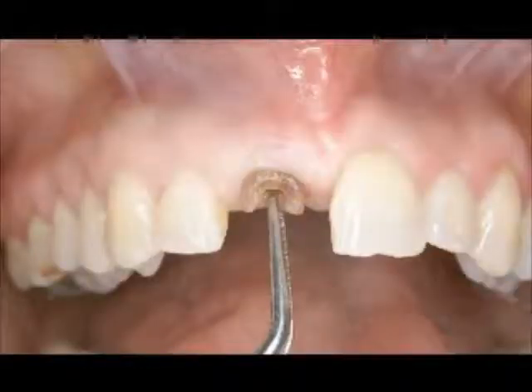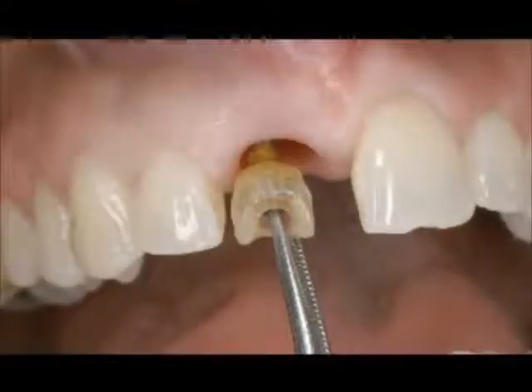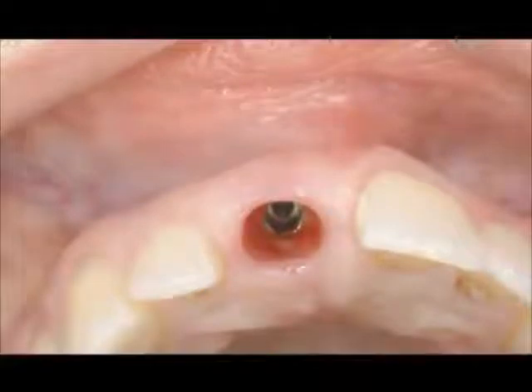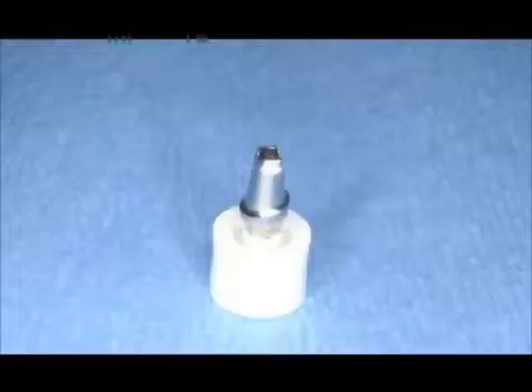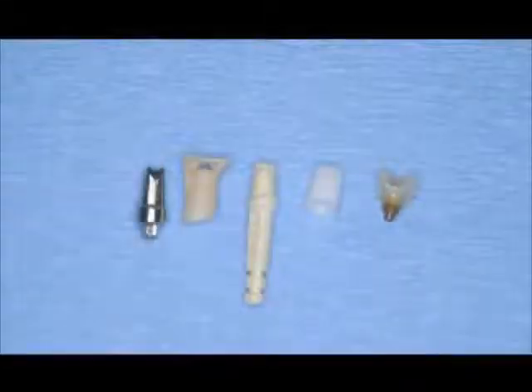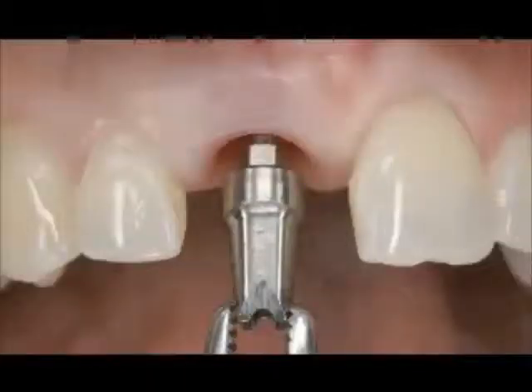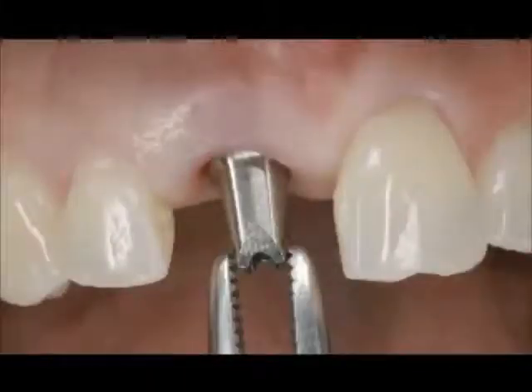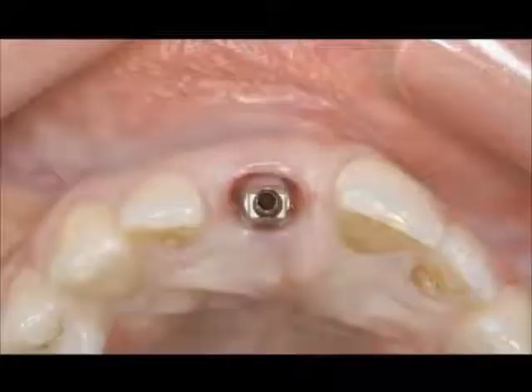At approximately 8 weeks, I can remove this healing cap, the contoured healing cap that mimics the shape of the HLA contour abutment that you were going to place now at the time of 8 weeks. And these are the components for this part. It's all snap cap componentry. The HLA contour abutment being inserted approximately, in this case, 2 millimeters high subgingivally off of the head of the fixture.